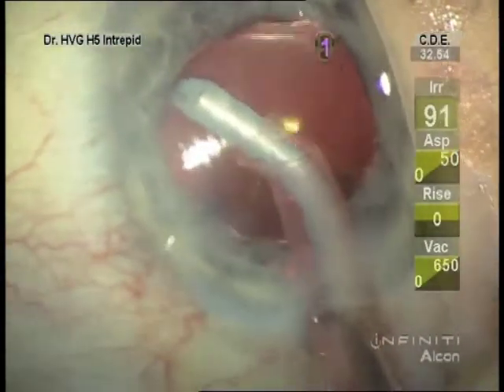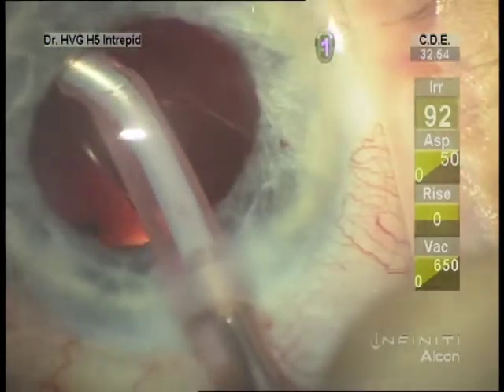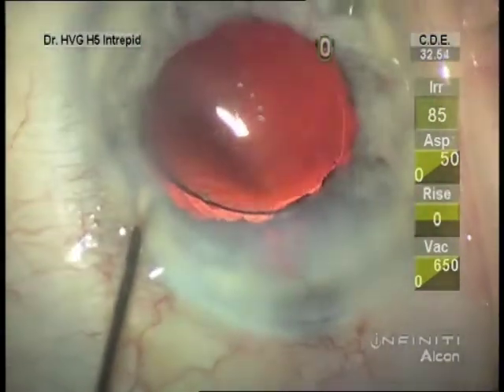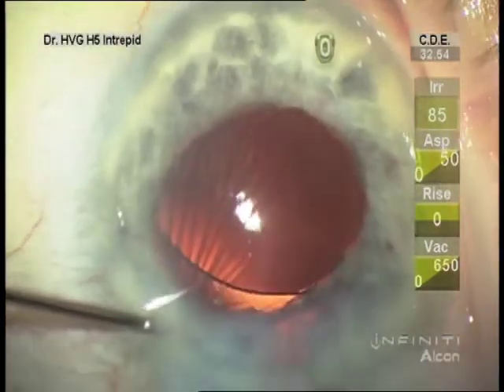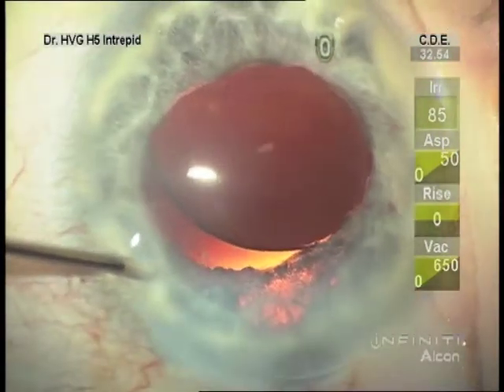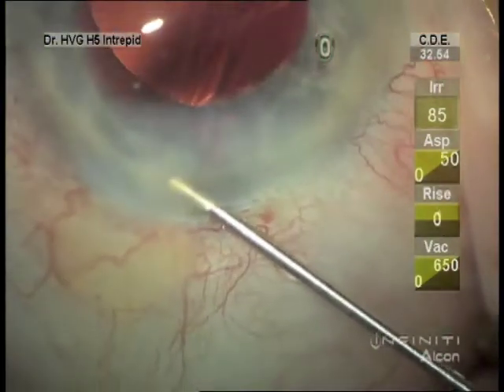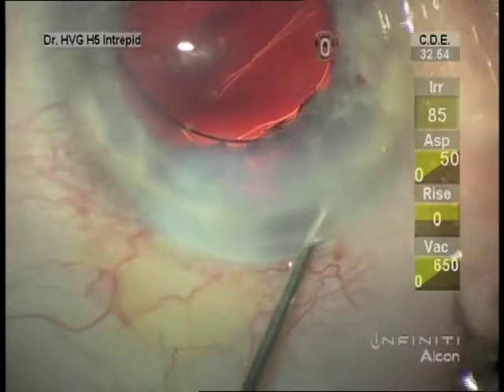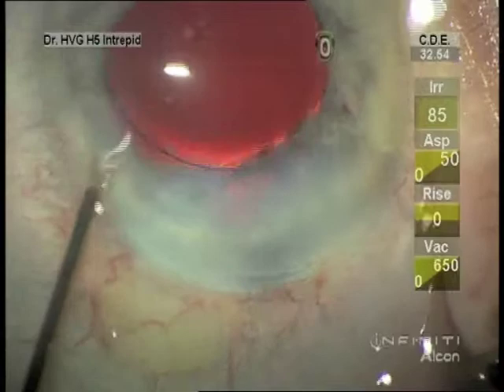Now the viscoelastic can be removed. The lens is positioned and rotated if toric. The wound is hydrated. You can see there's some iris trauma from the ring, particularly sub-incisionally there. The wound's hydrated and we've completed the case.